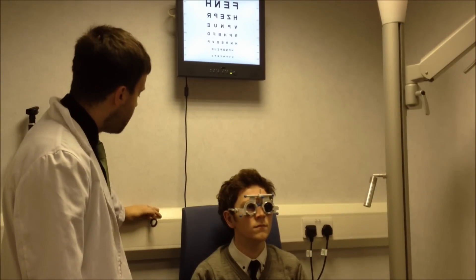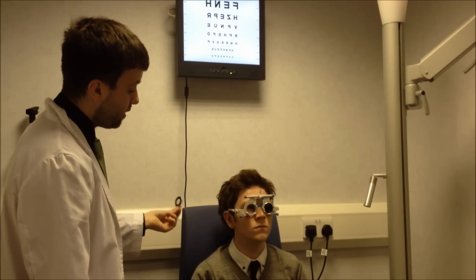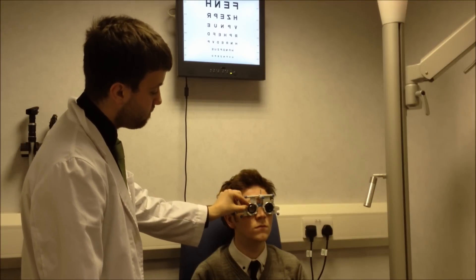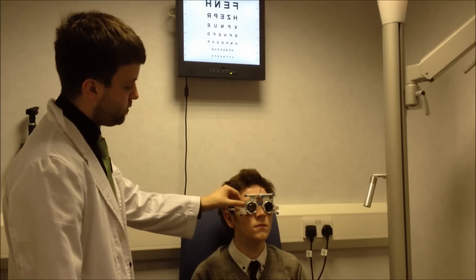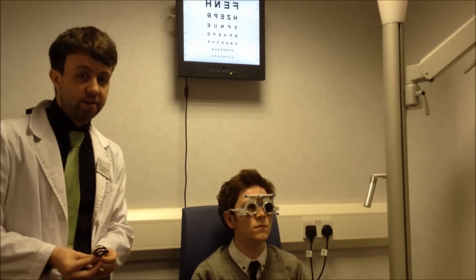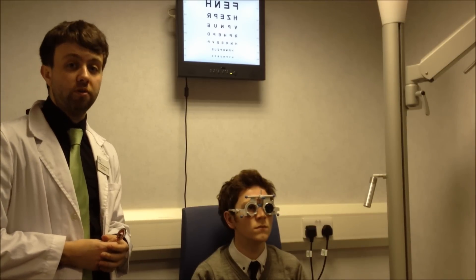Sean, if you look at that H again for me, I just want you to tell me if this makes your vision clearer or just smaller and darker. So from the over-refraction there we can see that the prescription of the lens is accurate and we won't need to make any alterations when we go to order the lens.